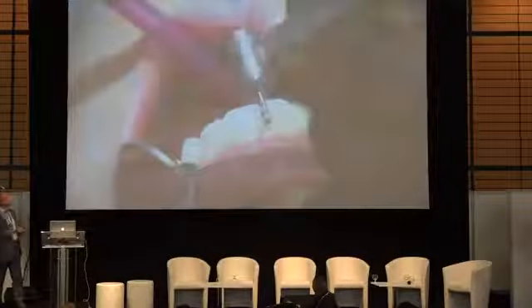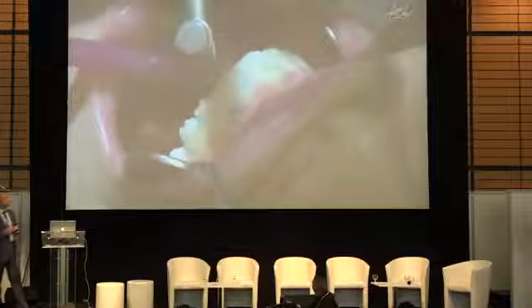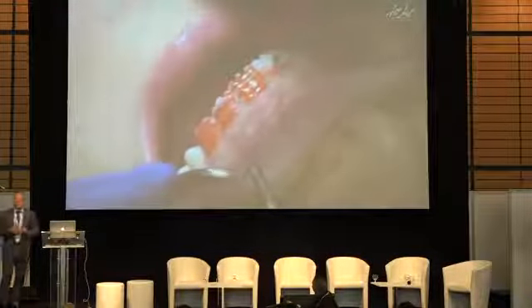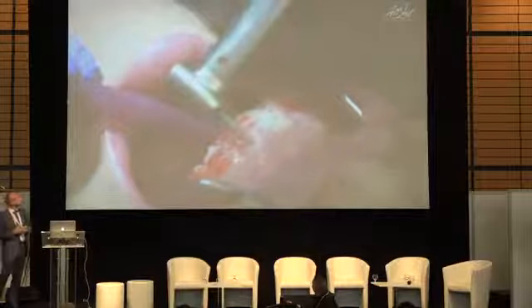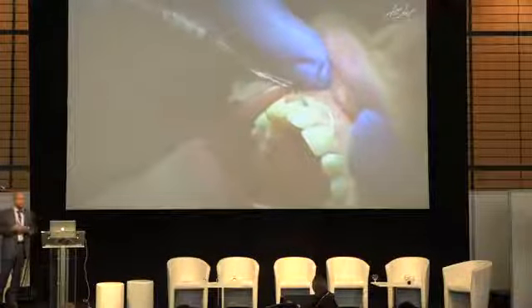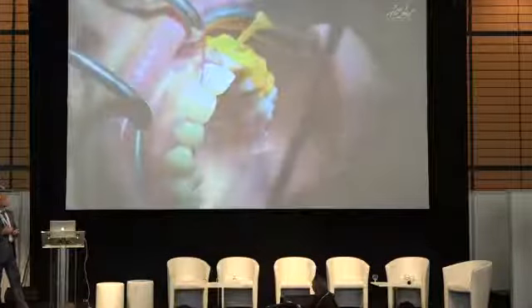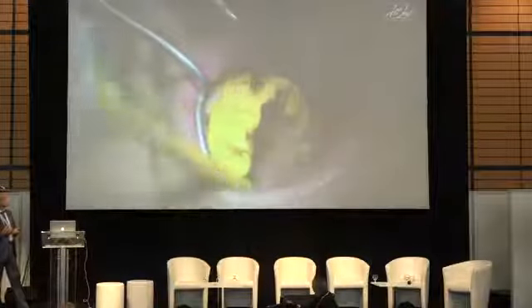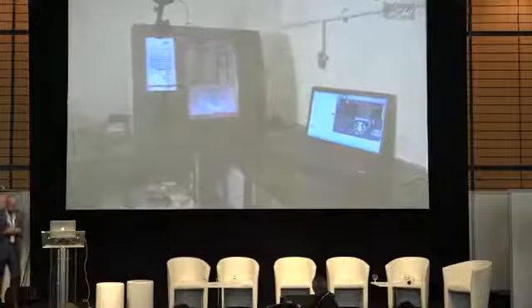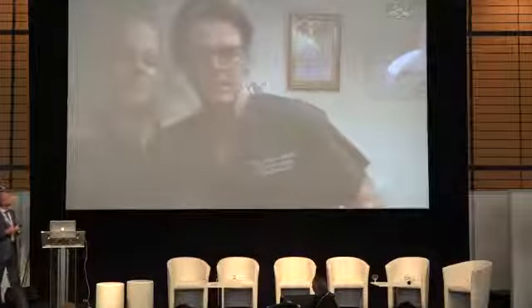So I never show the mirror to my patient. I make a photo, and after discussion, we start with grinding through the mock-up. It helps me to save tooth structure. And you see, we don't need to grind much if you use this protocol. Also, we scan the mock-up and proceed.